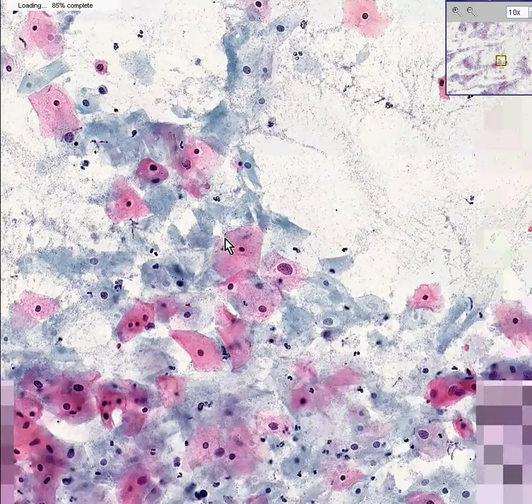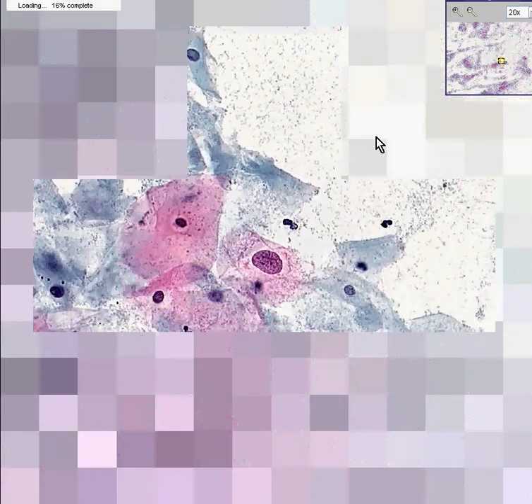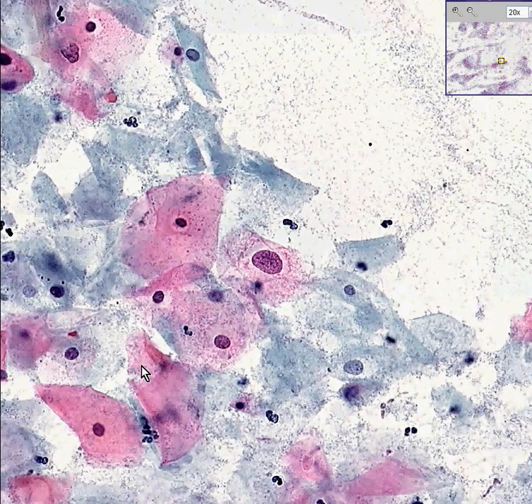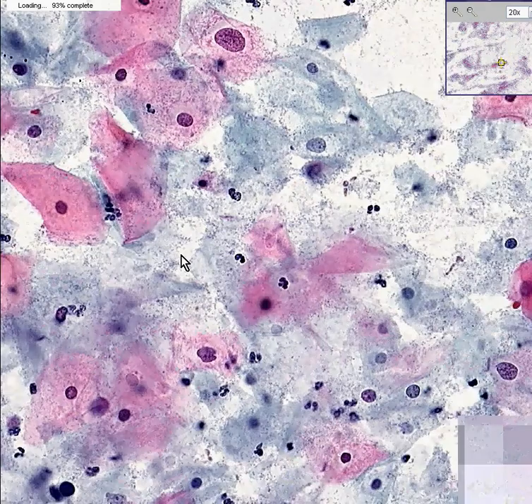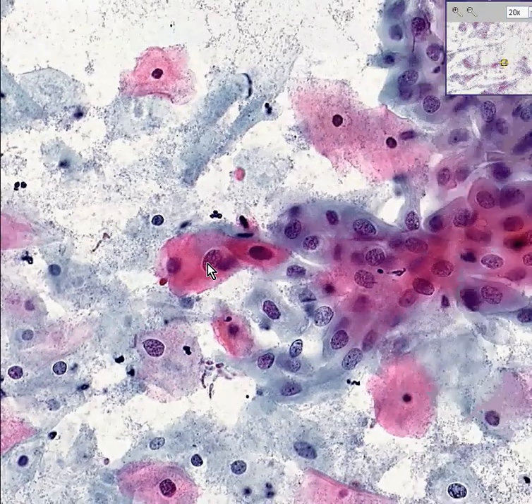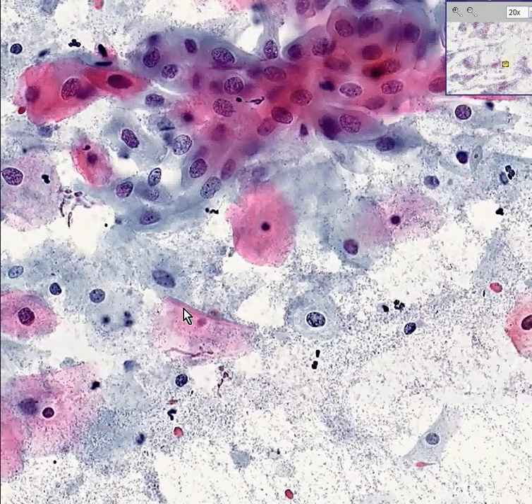There can be nuclear aberrations. Besides the fact that some nuclei are bigger, they could be darker, and they could be more irregular. And these are the things that cytotechs look for. If you could see these aberrations very, very readily, and they are fairly severe, you could probably call this a really worrisome thing, or severe dysplasia, or a high CIN, or now what they call a high-grade squamous epithelial lesion, or HSIL. That means it's very, very easy to find these nasty cells, and there's a lot of them as well. This is high-grade SIL on the Pap smear.